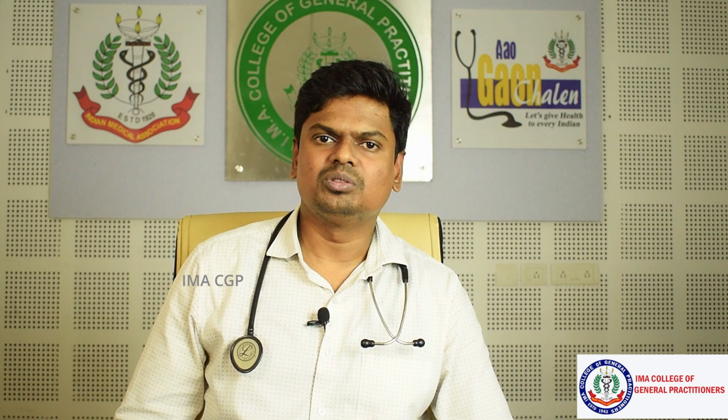What type of nebulizer to be chosen? That is the question in front of patients. There are 3 available nebulizers. One is the jet nebulizer, another is the vibrating mesh nebulizer, and the third is the ultrasonic nebulizer. The jet nebulizer is a simple electrical device that creates the aerosolization of the molecule. In ultrasonic nebulization, ultrasonic waves are used to disperse the molecule and the medicine is delivered. In vibrating mesh, the mesh is vibrated by ultrasonic waves and it gives out the molecule.